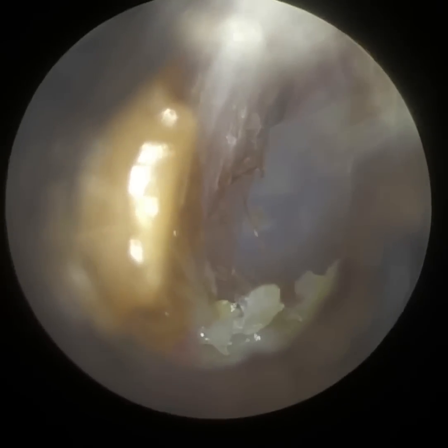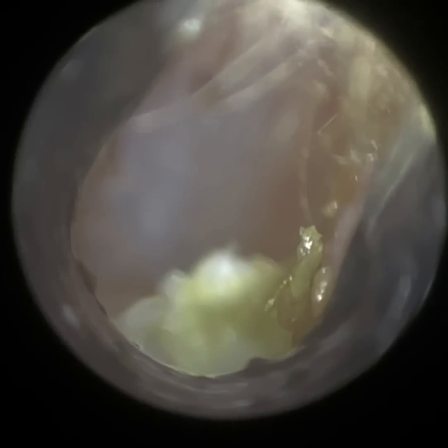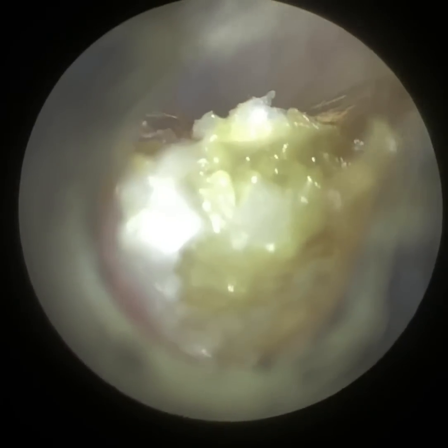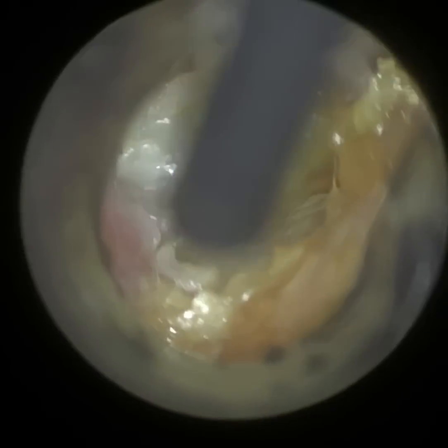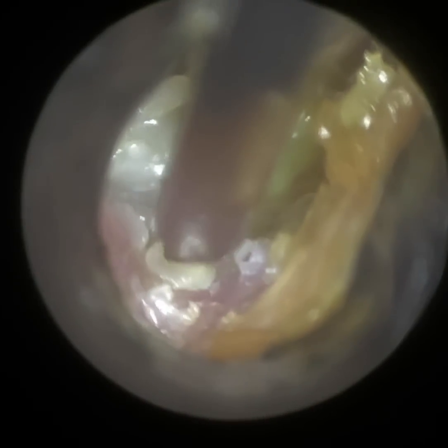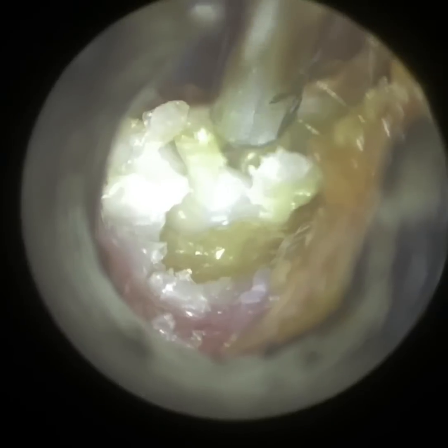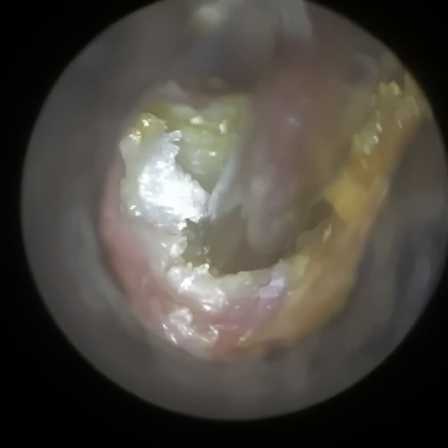There's just a bit of keratin near the entrance. I'm going to show you a comparison video of the iClearScope examining that area of exposed bone. There is no competition in terms of view — even compared to an ENT microscope or endoscope, you just cannot compete with an endoscope because it offers this wide panoramic view; it's almost like you're inside the ear looking around. The Waxscope is not designed to compete with an endoscope's wide field of view — instead it's the next best alternative. I've used head loops in the past, and that's what inspired me to develop the iClearScope, because with head loops I really struggled to see more medially towards the inner third and on the eardrum.